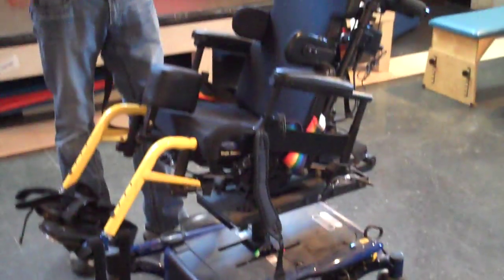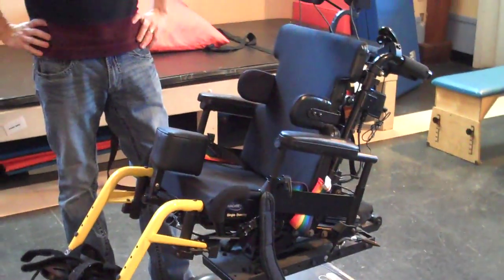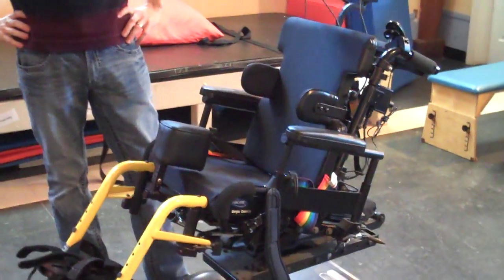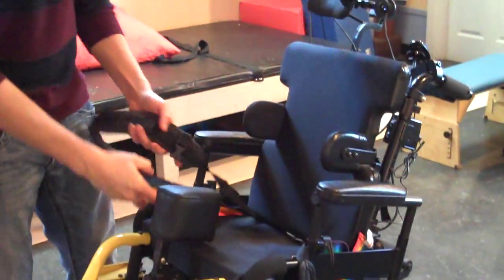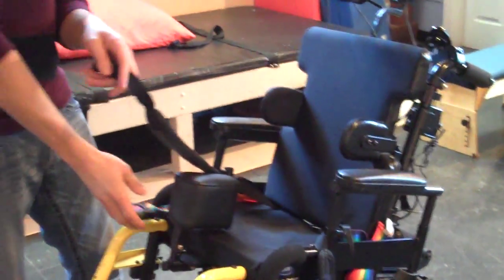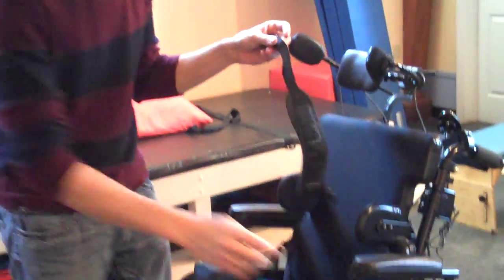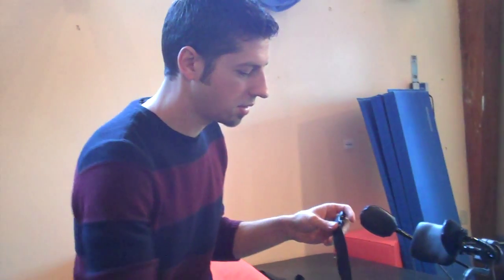So this is a pediatric power chair. This happens to be an Invacare TDX series.